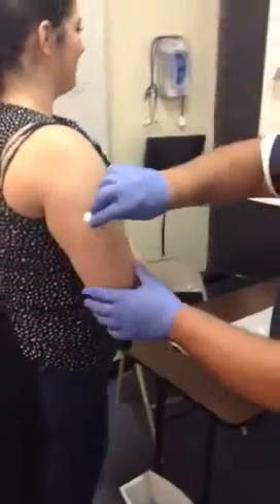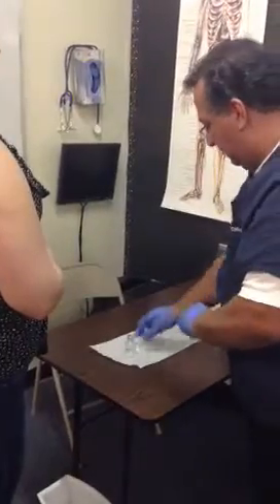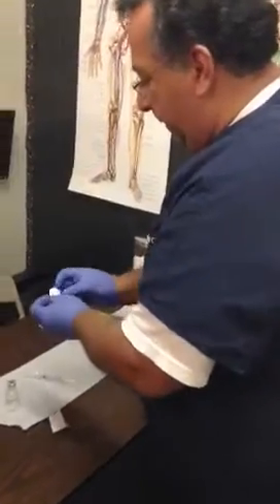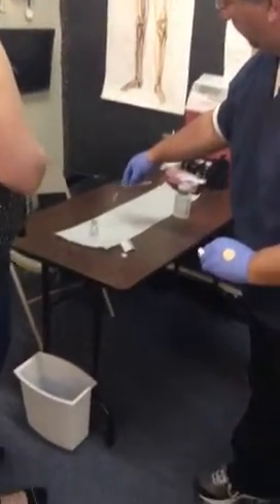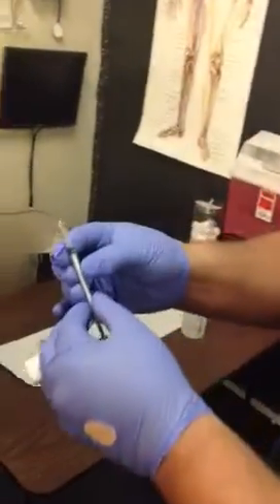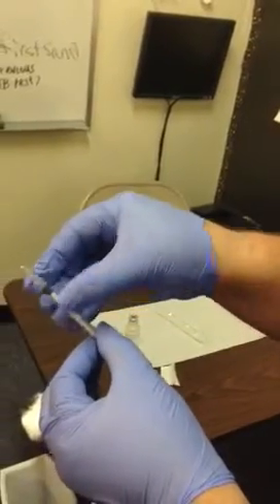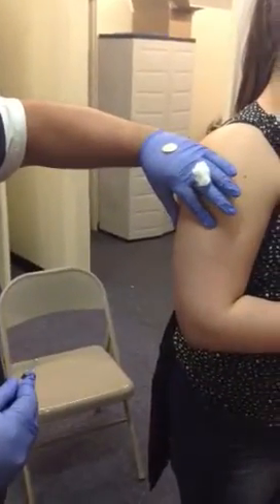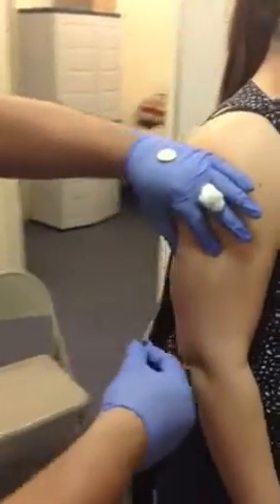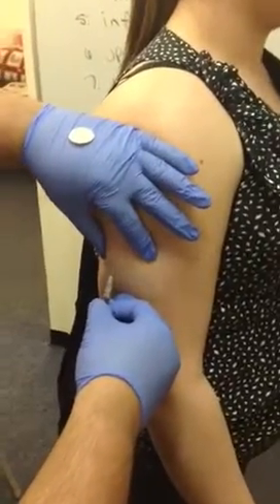Now that we know where we're giving the injection, clean the area using small to larger circles. Get your spot band-aid ready. With one hand, grab your syringe and tilt the lid off. Hold the syringe with four fingers behind and one thumb on top — fingers lying flat, not standing up like the intradermal. In that middle third on the back half, tent the skin up. Come in at a 45 degree angle — going right into the patient's arm at an upward angle. Ma'am, you're going to feel a stick in one, two, three.